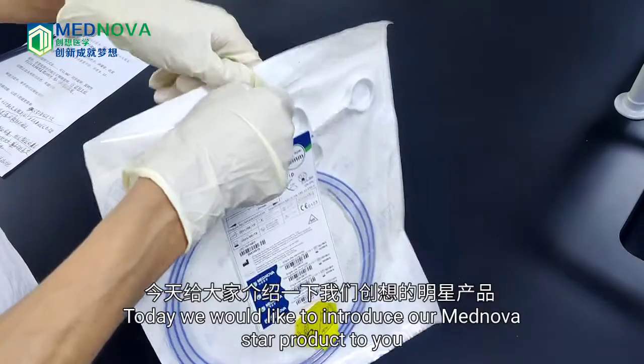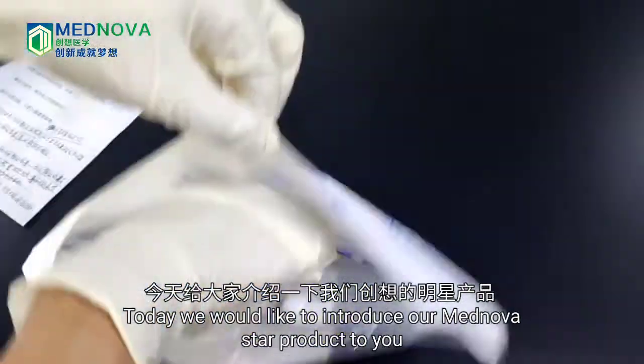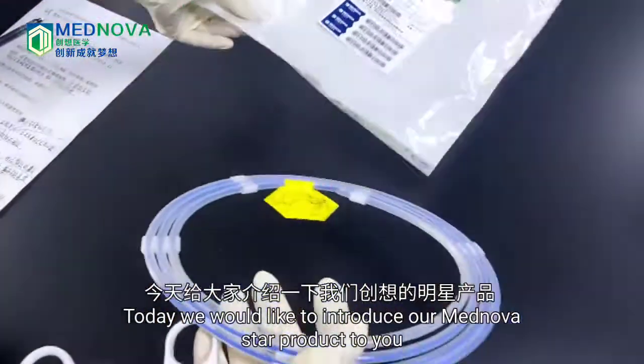Hello everyone! Today, we would like to introduce our Mednova Star product to you.